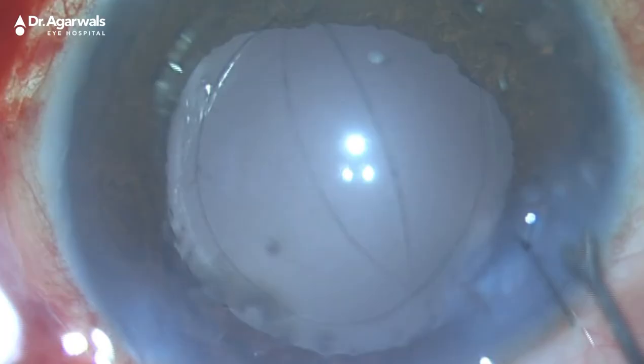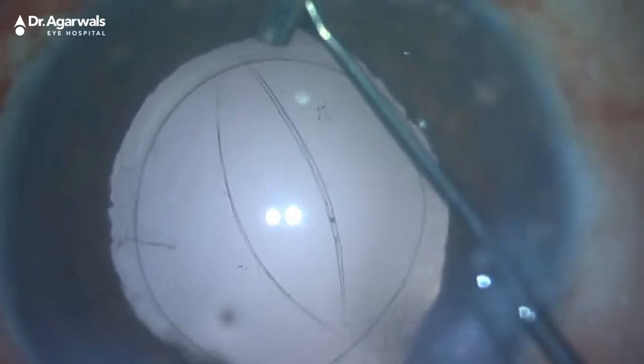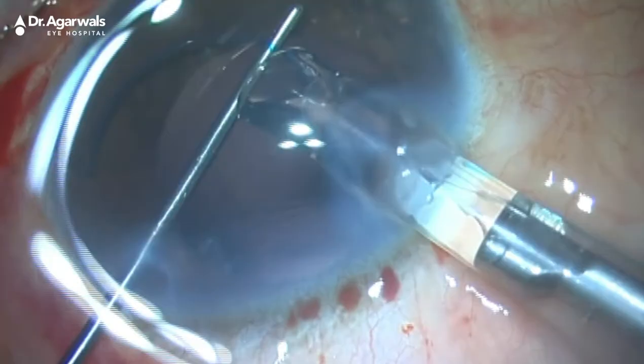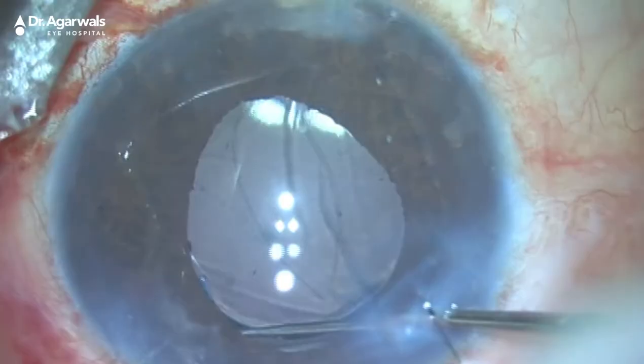The question arises: what if there is a rent to the posterior capsule, which can happen to any experienced surgeon? In the event of a large posterior capsular rent, it may not be possible to insert the lens into the capsular bag as desired. We have other options — sulcus-supported lenses — but for this we need the support of the anterior capsular rim.